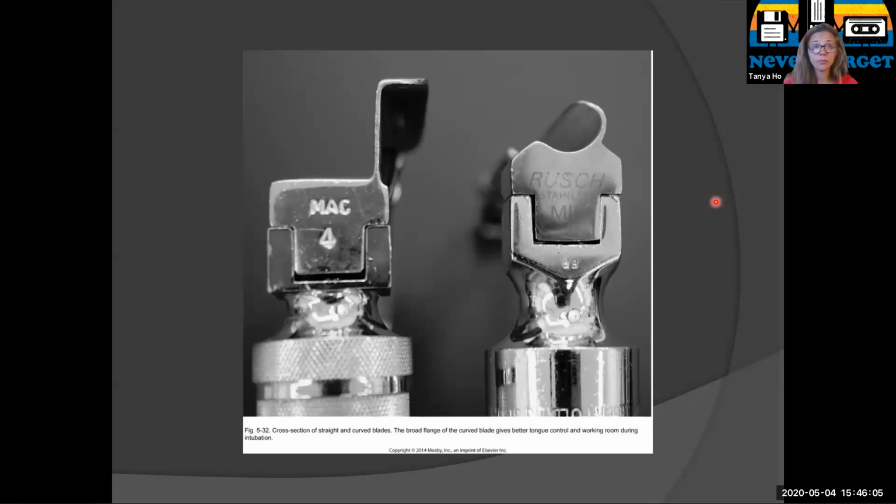But if you aren't performing the intubation, you are the critical key player in getting all the equipment together. You're standing right beside the physician performing the intubation, gathering all the equipment and setting everything up. And whoever does the intubation, it doesn't matter, we're the ones who secure the airway afterwards. So it's totally our thing.